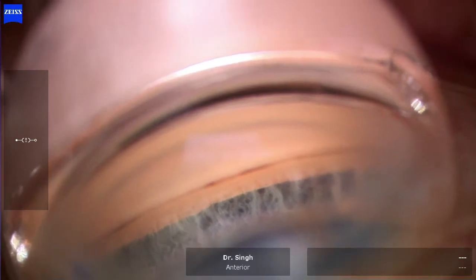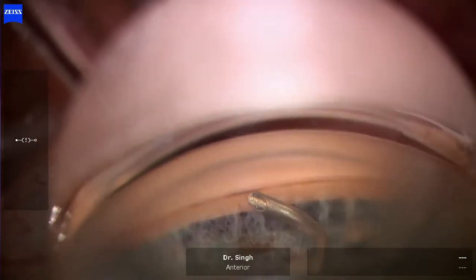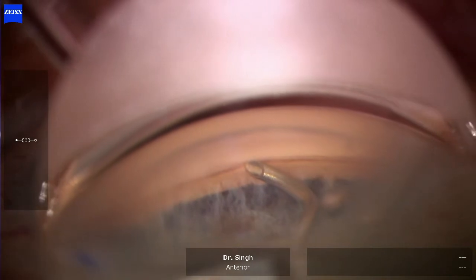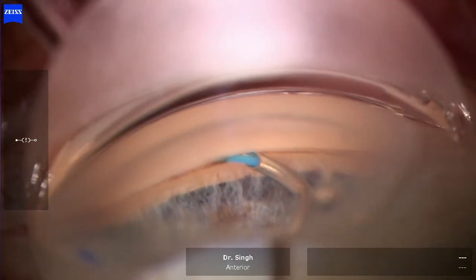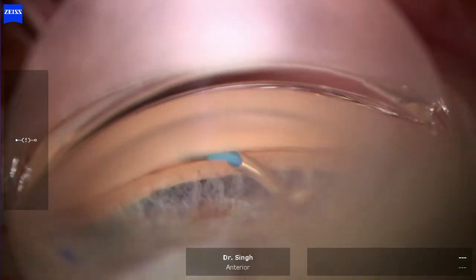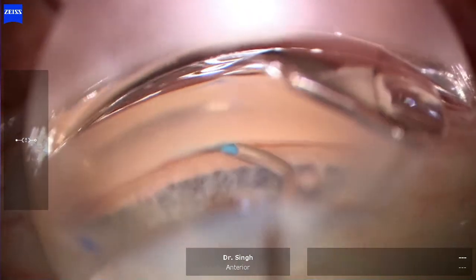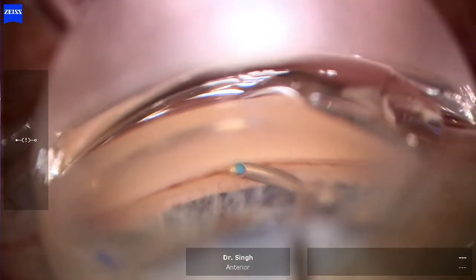The view is still the key of any successful MIGS procedure. Entering here with my Omni device, my Omni loader — I'm going to engage the TM. I like to be at about a 45-degree angle depending on the patient. I'm not pushing too hard against the nasal angle, but as I advance this wheel, I'm feeling resistance and you can see the blue catheter almost pushing into the wall of the sclera.